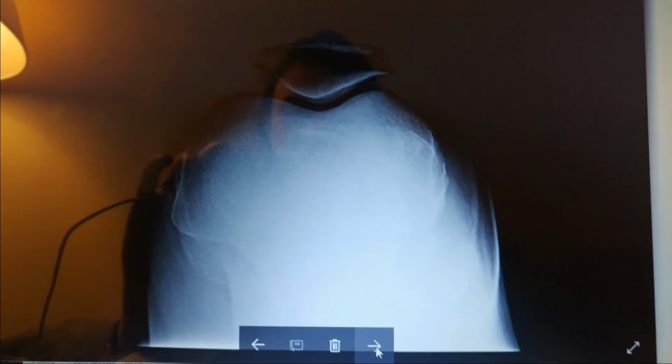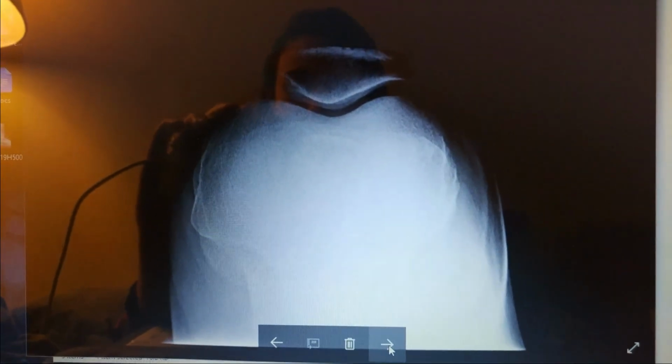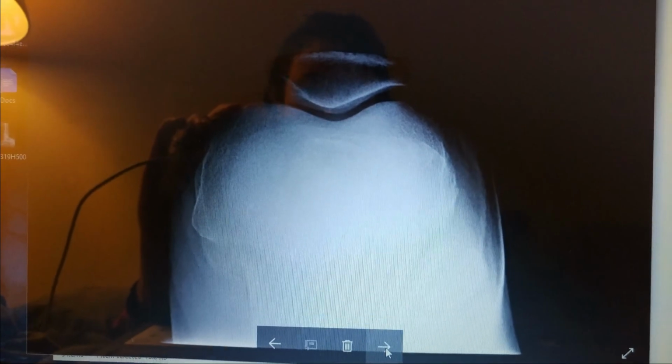The patella needs to be in profile, so you can see it kind of projected above everything there. This is the Settegast method that I did for the video, and they call it sunrise because it looks like a little sun rising over the mountains. And yeah, that is it for that one. So let's go on to the next image.